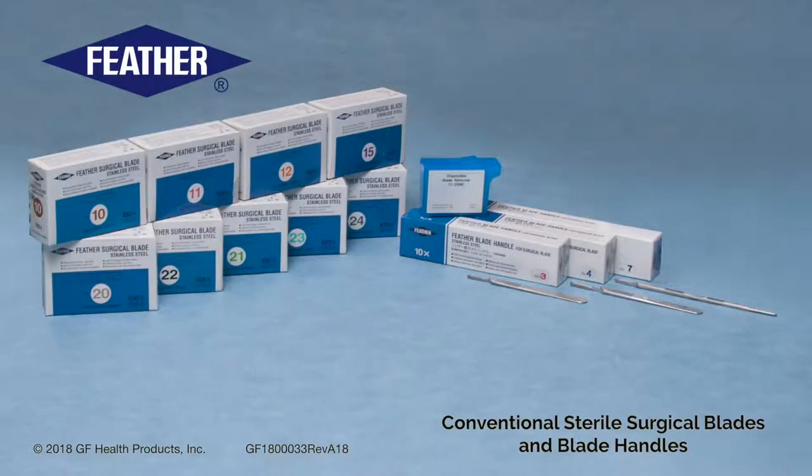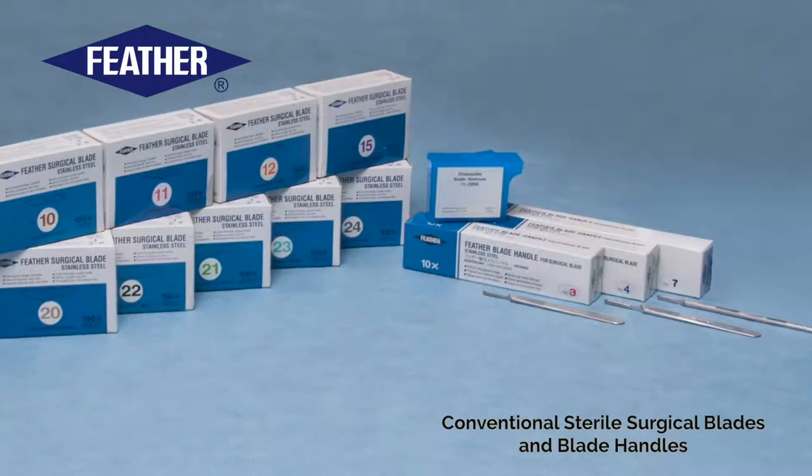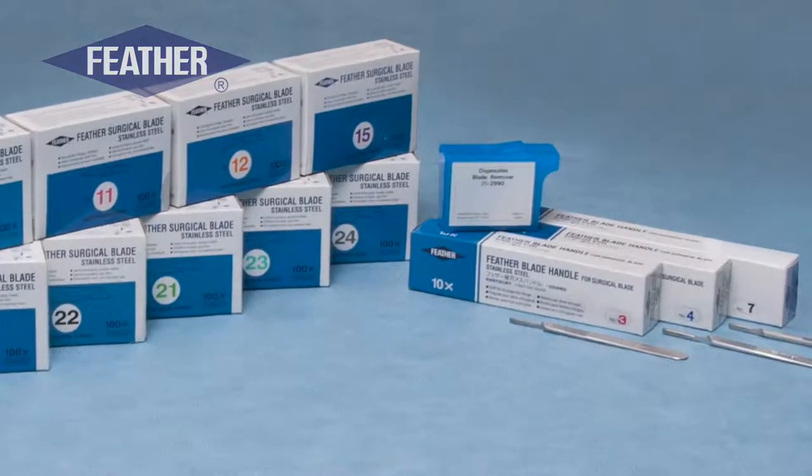Introducing Feather Conventional Sterile Surgical Blades and Blade Handles. As Japan's leading manufacturer of fine cutting instruments, Feather utilizes high precision technology and carefully selected materials to carry on their master craftsmanship legacy.